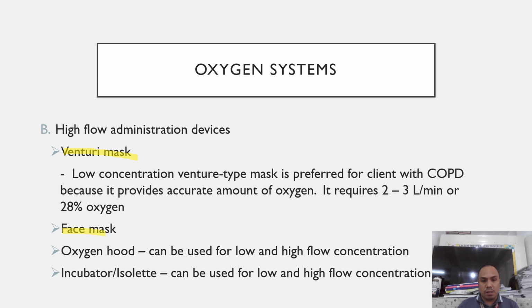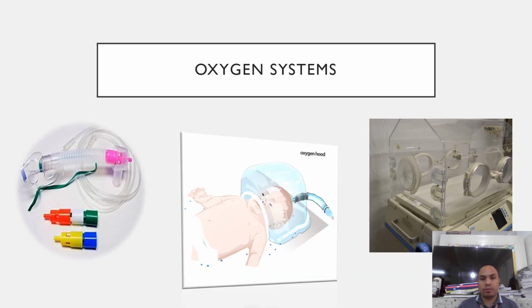So meron din tayong face mask doon. It's the same with the low flow administration devices. We have also the oxygen hood that can be used for low and high flow concentrations. And then we have the incubator or isolette, which can be used for low and high flow concentrations. Okay, so ito yung nakikita natin na example ng ating high flow delivery system of oxygen.